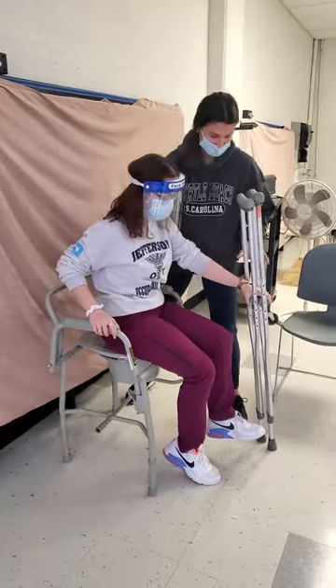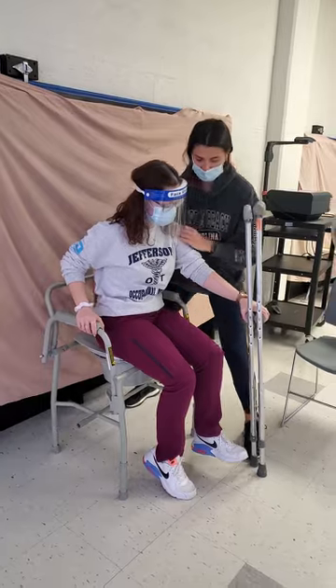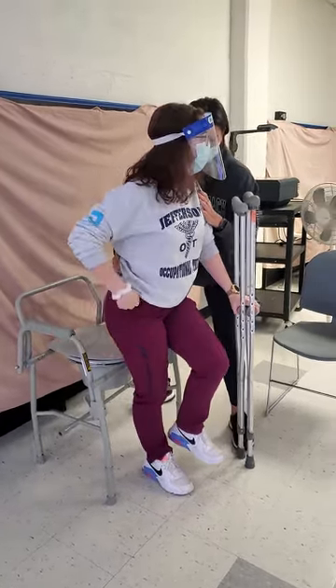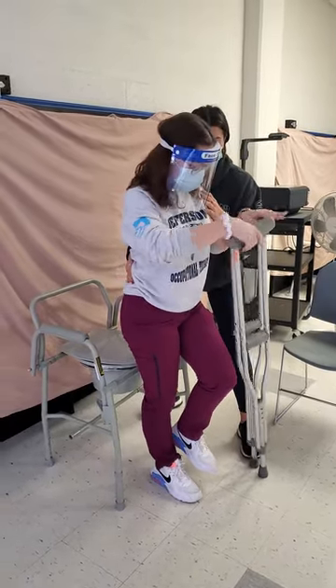And then we're going to do the same thing. We're going to stand up on the count of three. You're going to push off here and use these for support. One, two, three. First you have to push off your hands. Okay, and then put the crutches under your arms.